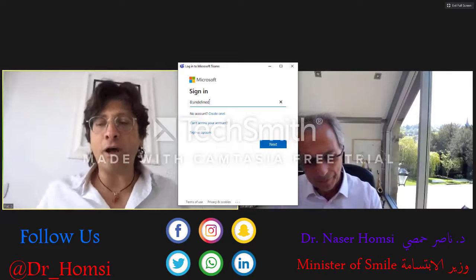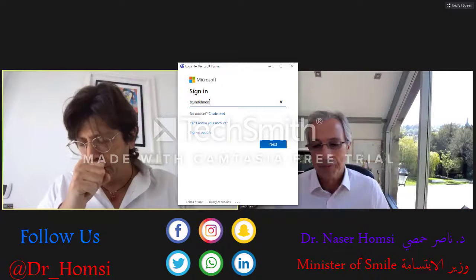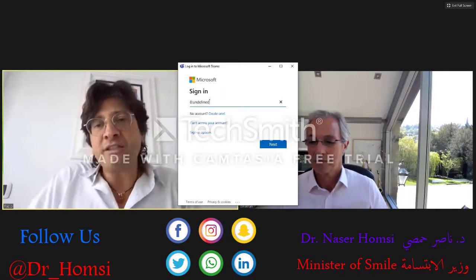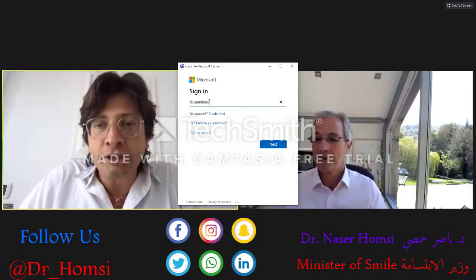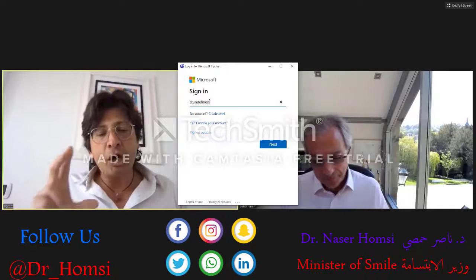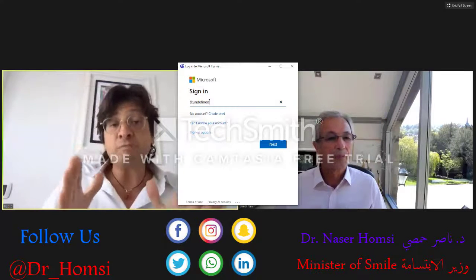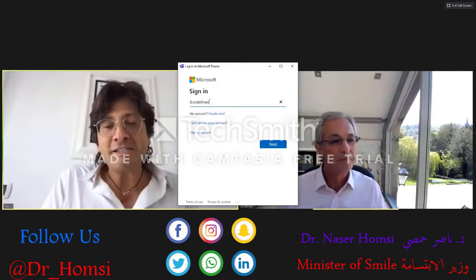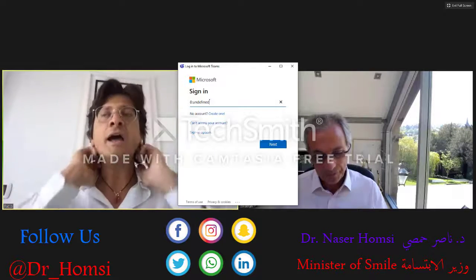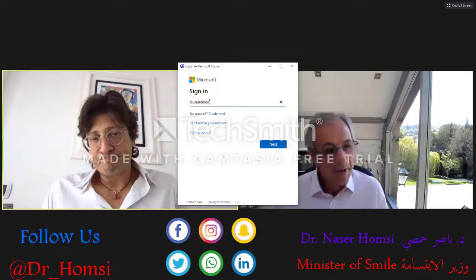Jonathan, to be honest, we know that all over the world people do a lot of correction like IPR, for example. Sometimes we do IPR over 2 millimeters, even if we don't have a dental size discrepancy. So we can think that this kind of threshold can be treated without a second step or without interdisciplinary treatment. But the meaning of that paper is to stay aware. Be careful if your patient goes over 2 standard deviations or over 2 millimeters, because this threshold is clinically relevant. If you don't treat with some corrections, or with 2-phase or 3-phase treatment like Tiziana, you can have unsatisfied patients, because they will finish and you have to manage some spaces where to place this. Thank you very much.